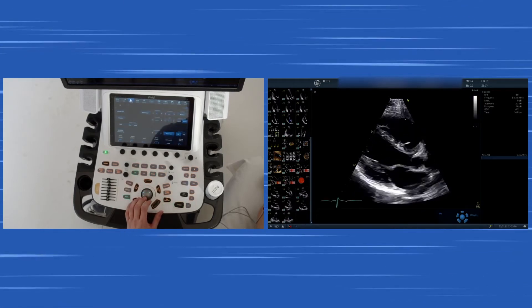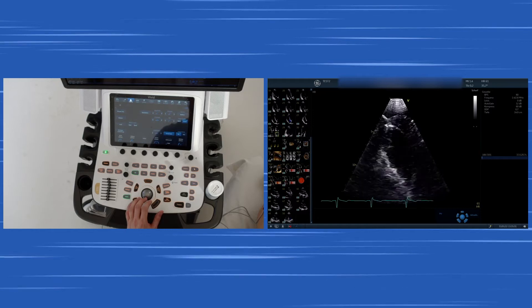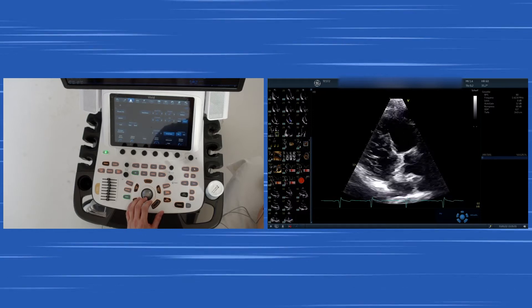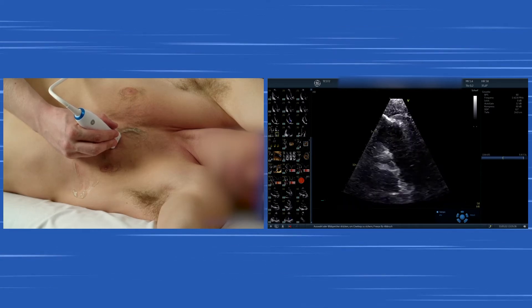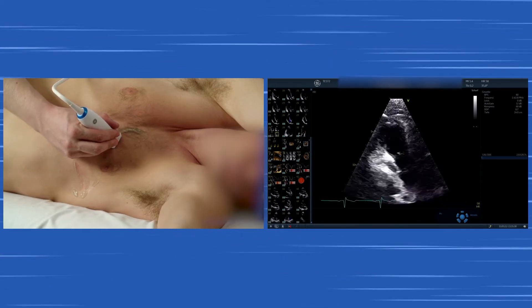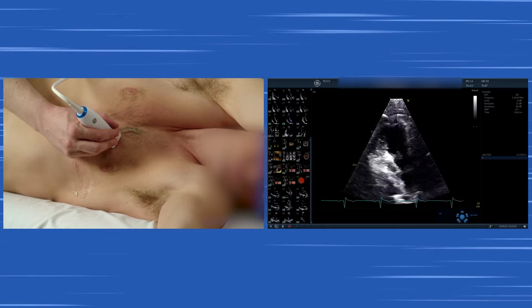Tilting the transducer upwards will result in a view of the pulmonary artery and the pulmonic trunk and the RVOT and the pulmonic valve in the center of the image. Now you can visualize it quite nicely over here.